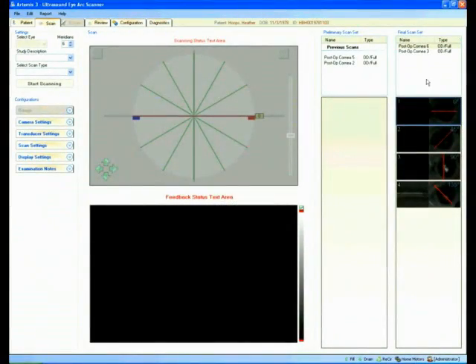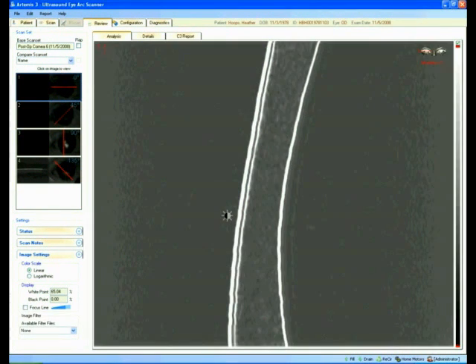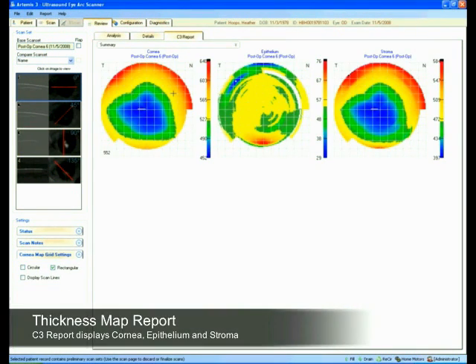To generate a report, select the scanset and go to the review page. Here I can see the front of the cornea, the back of the cornea, and Bowman's interface. I adjust the brightness and contrast a little so I can see the backscatter within the cornea. I can see remnants of a LASIK flap — this patient had LASIK five to six years ago. Then I click on the report button. This shows thickness maps of the cornea, the epithelium, and the stroma.